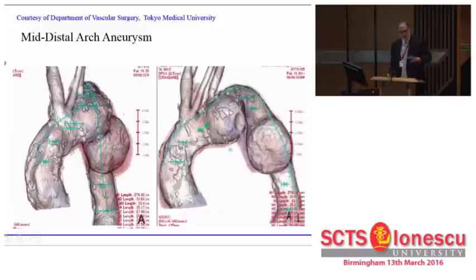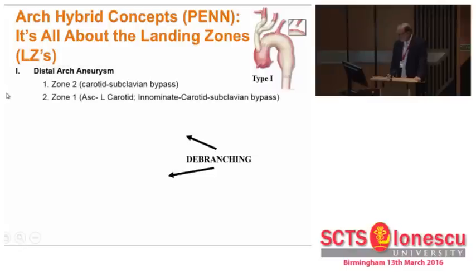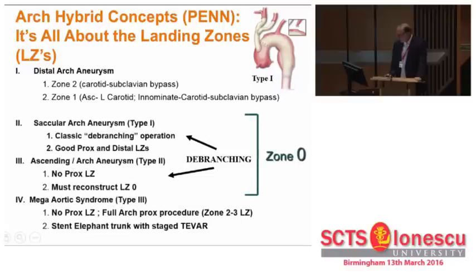This is where we blend into making a decision, coming in from an open case from a left chest or from the sternotomy, which is where these operations are most appropriate. So really it's all about the landing zones. We're not going to talk about zone two or zone one in this discussion, although that is, I suppose, a hybrid procedure in the true sense of the word. But really what we're talking about here is this.